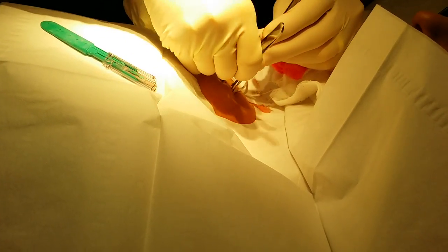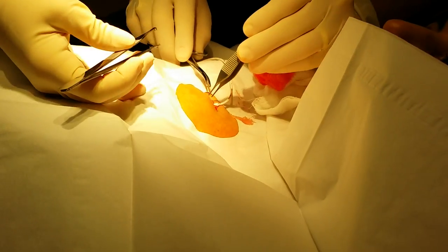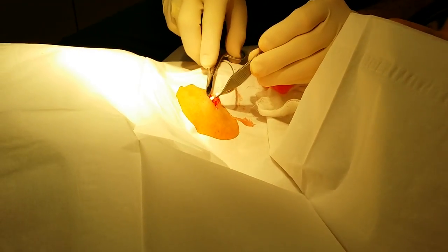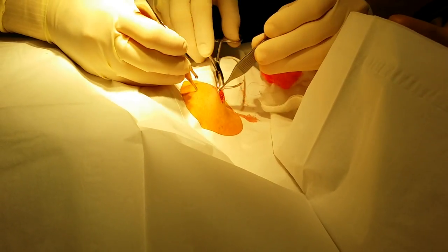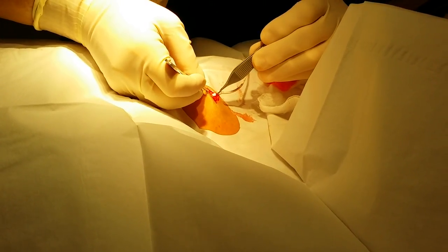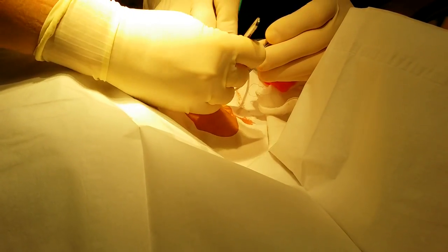Now we want to get a hold of the actual port, and this is the hard part. That was easy? That was the easy part. The port itself is a little under the skin and the body again doesn't like it, so it makes a capsule here — it's all attached to essentially everything in there. We just kind of grab it and hold it, then have to free it up from everything around it.